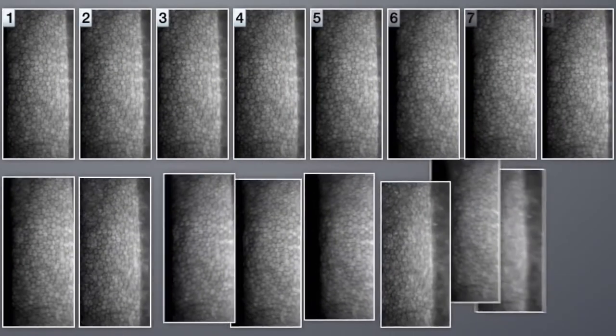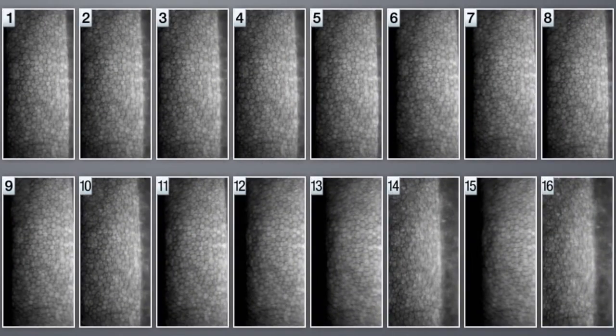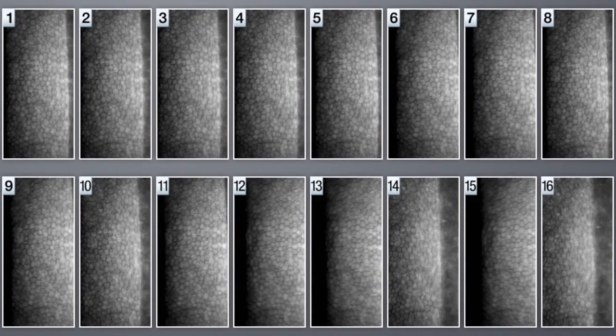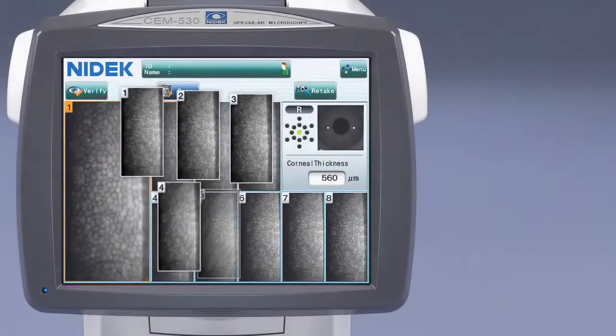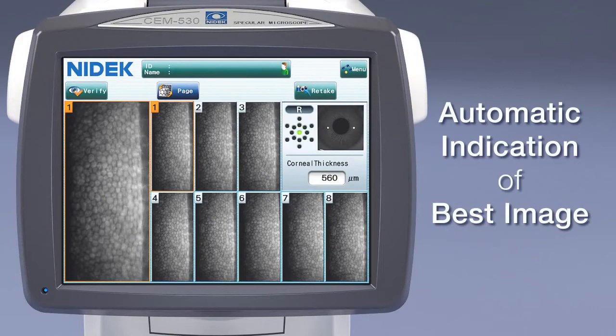Within each imaged area, many images are captured. Then, 16 images are automatically selected and sorted based on their individual quality and ability to be analyzed. These images are presented 8 at a time on the touchscreen for easy selection of the desired image.